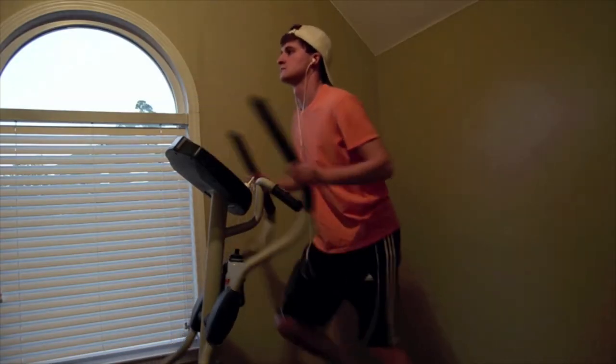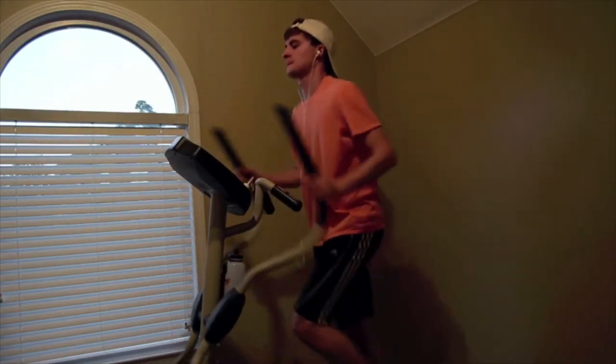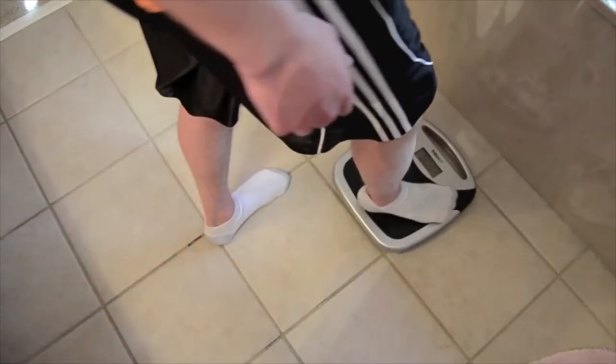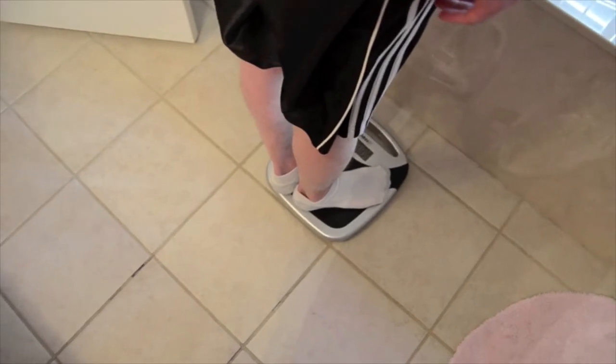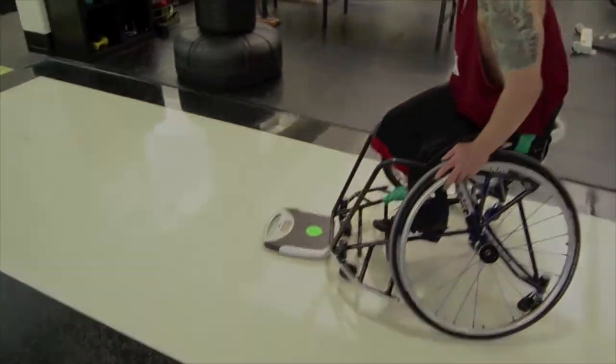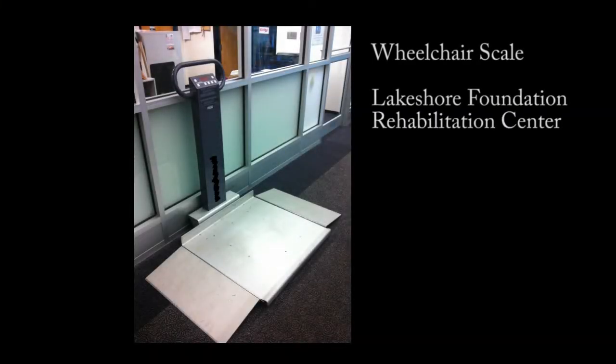The process of monitoring an individual's weight after exercise is a relatively simple process for individuals without disabilities — they simply have to walk into their bathroom to use a scale. However, as you can see here, this is not the case for individuals that use wheelchairs. Due to the size of wheelchairs, users must have access to a larger scale in order to safely and accurately measure their weight.